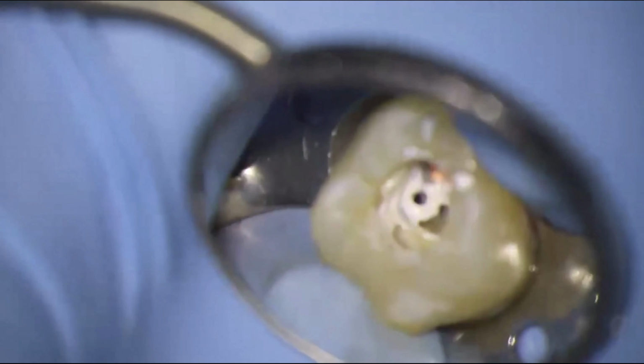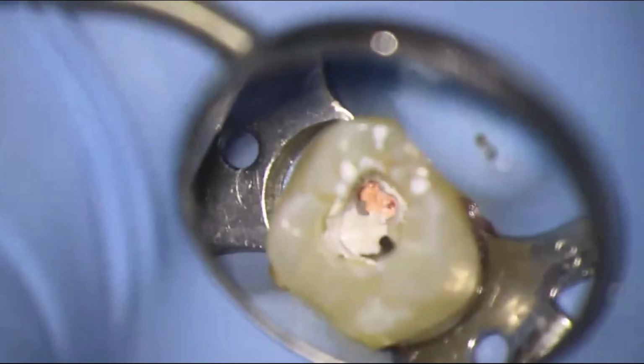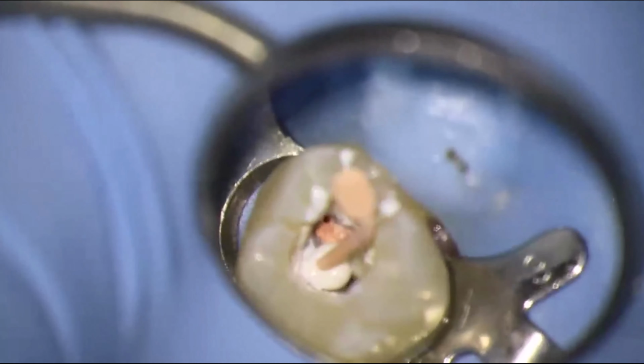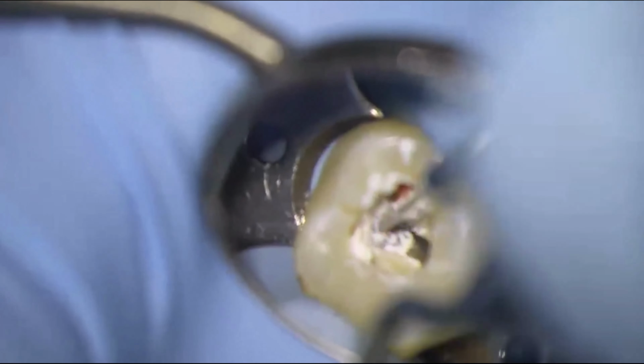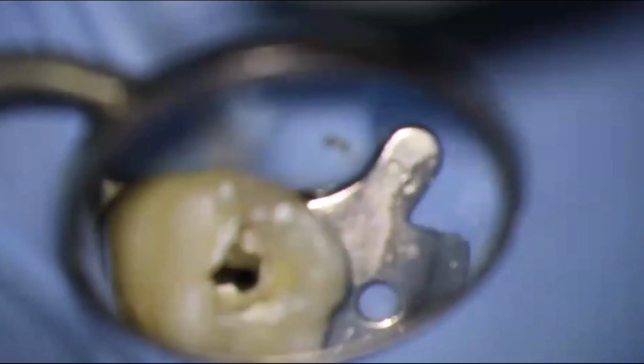Here's the distal canal, seat out, more sealer, final seat, and then we're going to heat, we're out, and we're going to seat the obturator needle, hold it, push, and then extrude our gutta percha. We're going to pack, and then we'll get to the last canal.